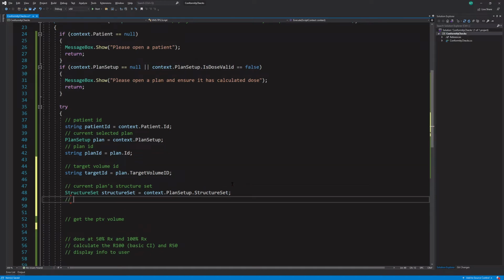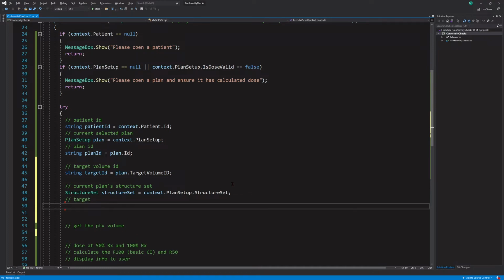So we want to get the target. So this is a structure. Target equals structure set. And actually, I'm not doing this the longest way possible. What you would do is you would actually have to, so I'll show the long way. So we would say foreach var s in structure set. Here I am using var because I don't need to be explicit. S is short for structure in my mind. You can also type out structure if you want.